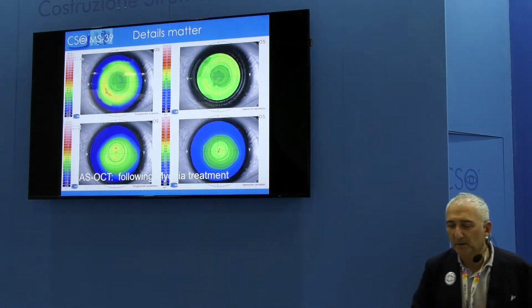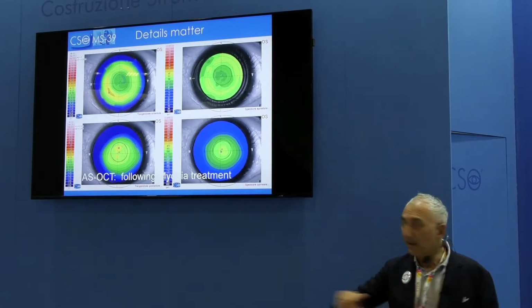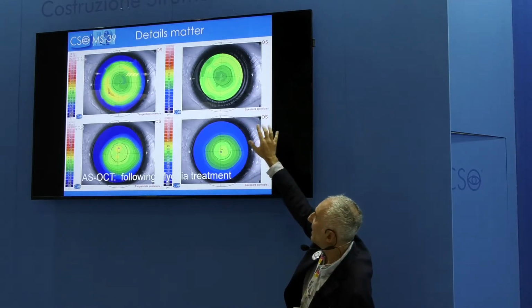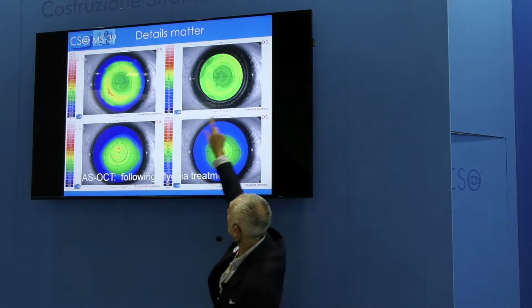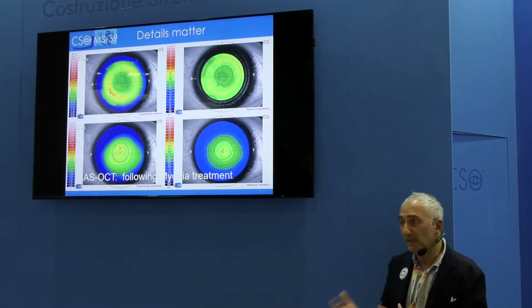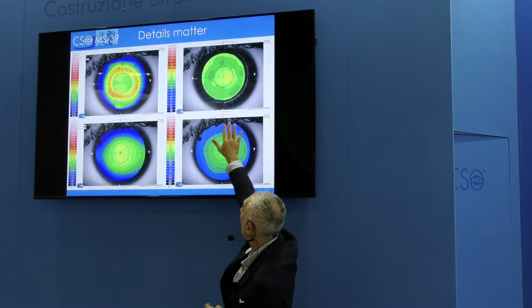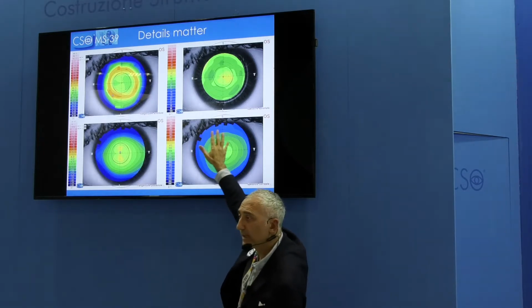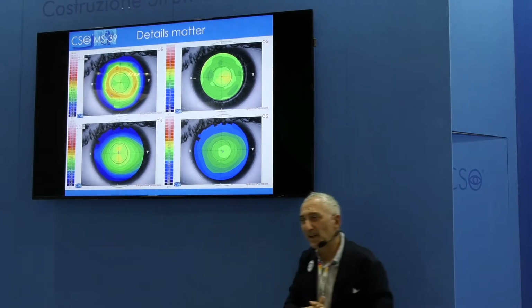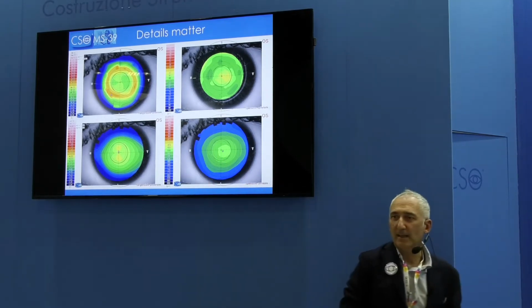This is after a myopic treatment, and we can follow the epithelium. Here is the epithelial thickness, and you can see how in a myopic treatment the thickness is higher in the center because we create a kind of valley, of course. But we can measure it. This is also a myopic treatment, but it is just the other way around because this is orthokeratology. That's the effect of orthokeratology. So ortho-K on purpose does just the opposite to obtain the same picture we can obtain with laser.